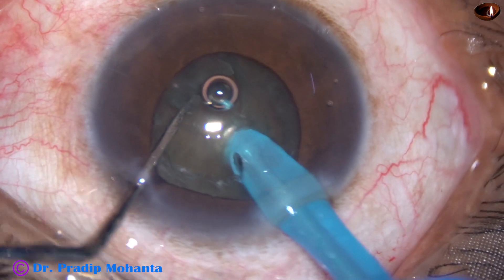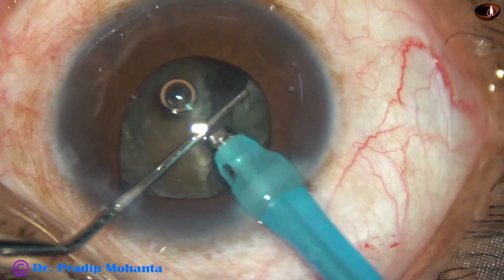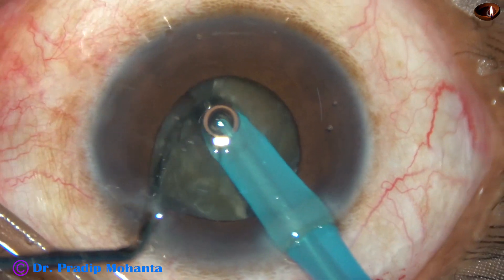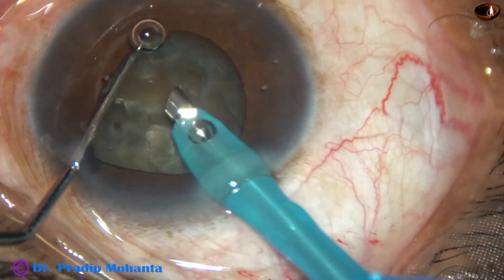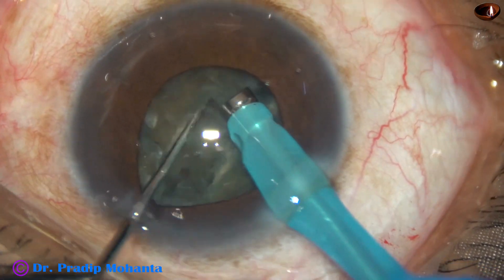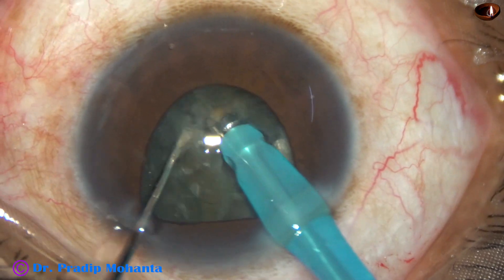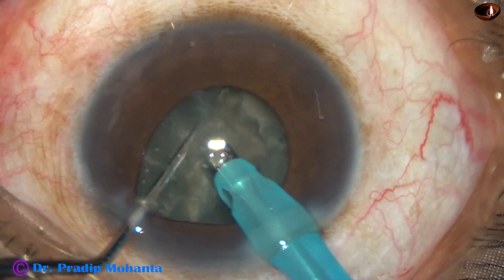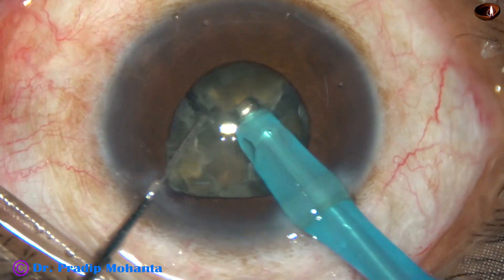See what happens — the pupil has become small. Iris tends to prolapse through the side port, but I have been able to manage a nice crack. Rotate the nuclear mass 180 degrees and divide the nucleus completely into two halves. There is an air bubble disturbing me, so I try to remove the air bubble and it comes off. Now this hemi-nucleus is being subdivided into two halves. I rotate the nuclear mass again, get onto the other half, and this hemi-nucleus is also divided into two parts.